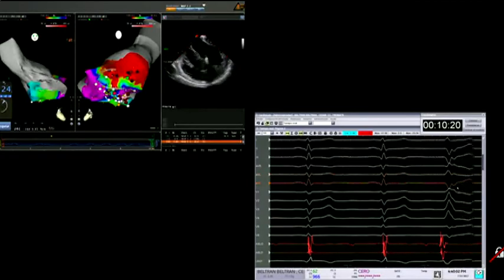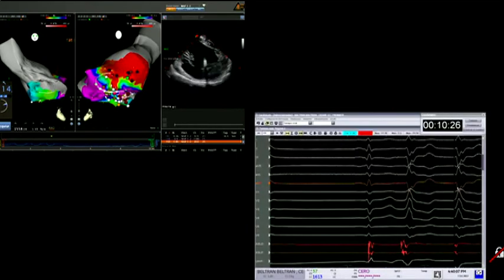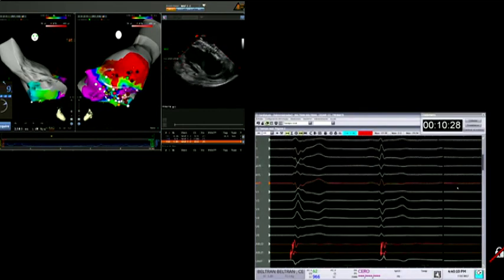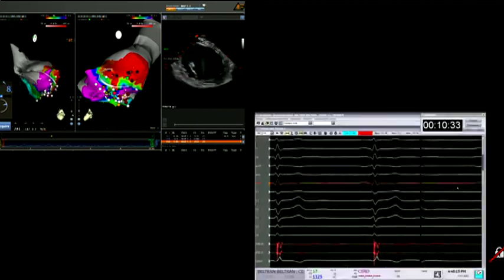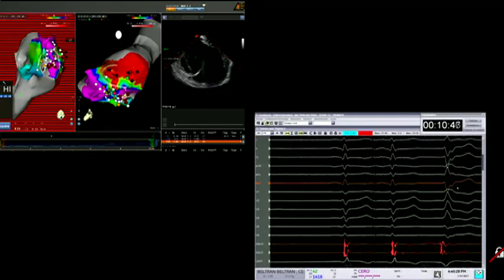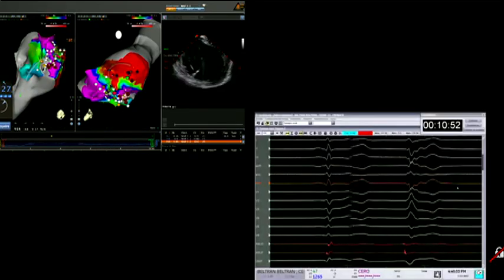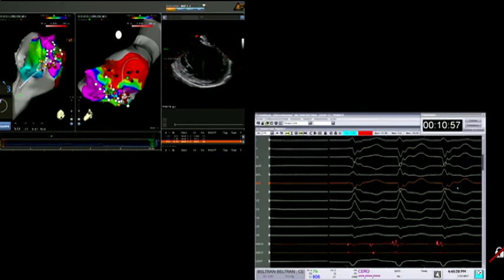Well, we have to choose a sinus point here. Here it's quite large. To the left image, please show me. Move it up a bit more, a bit more. There is a lot of contact. You can choose any point whenever you can. That's a scar, and this has been burned.